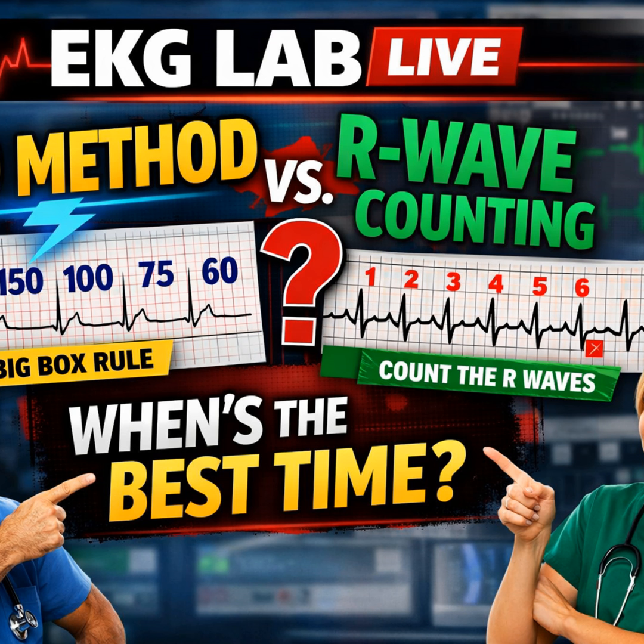You might end up shocking a patient who just needs fluids. But if you use the big box method, you can prove the regularity. VTach is monomorphic. It marches out with terrifying precision. Sinus tach usually has some slight variability. The big box method reveals that regularity. The strip method just blurs it.